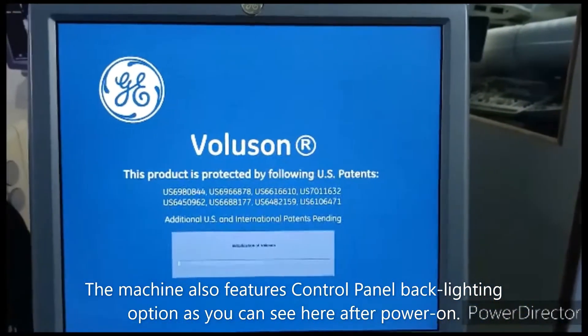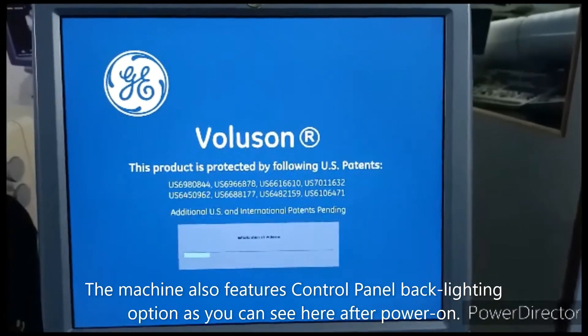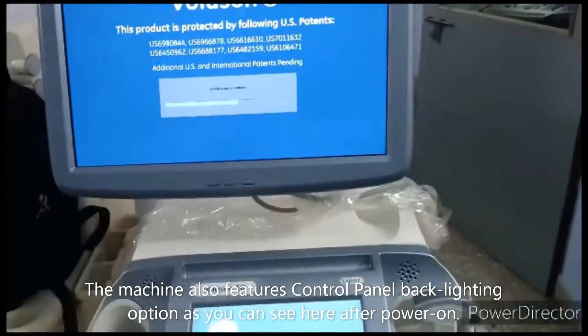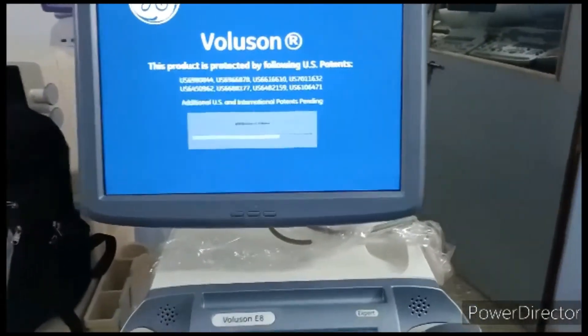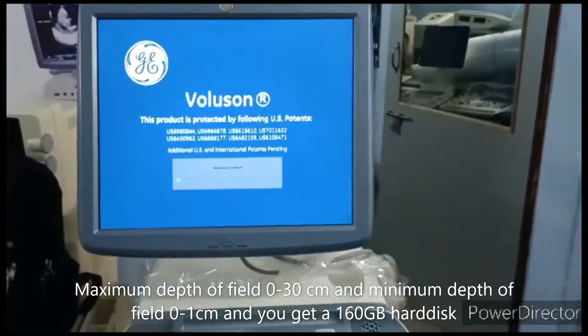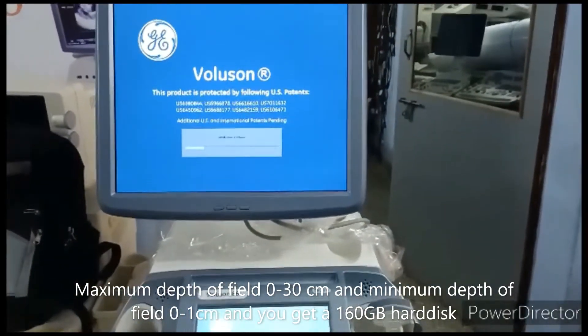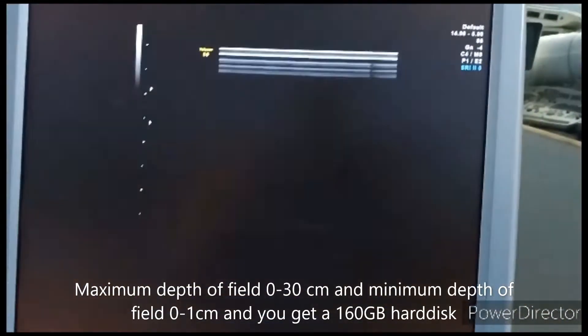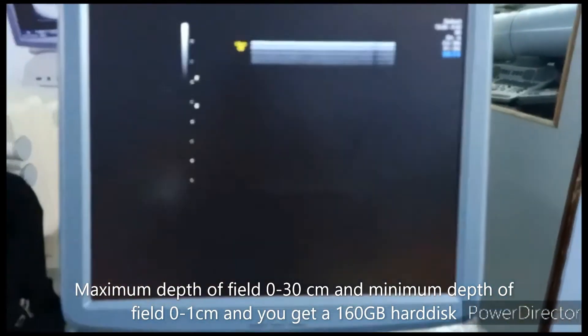The active ports are three and one non-active port. The maximum depth of field is 0 to 30 centimeters and the minimum is 0 to 1 centimeter. The hard disk is 160 GB. Now boot is completed — you can see the scan area and the options and measurements in this monitor.